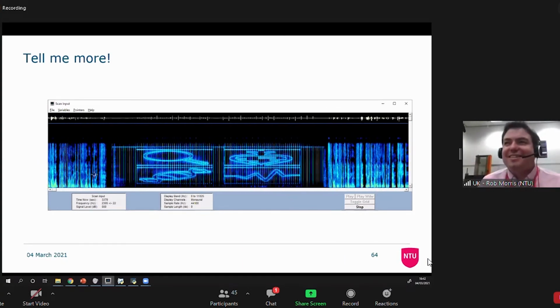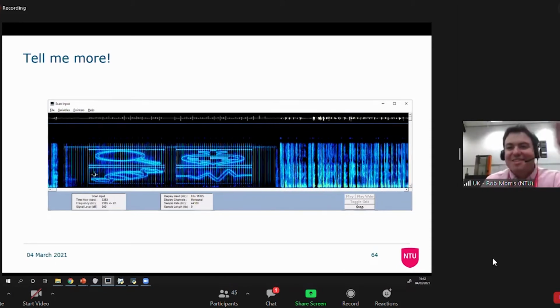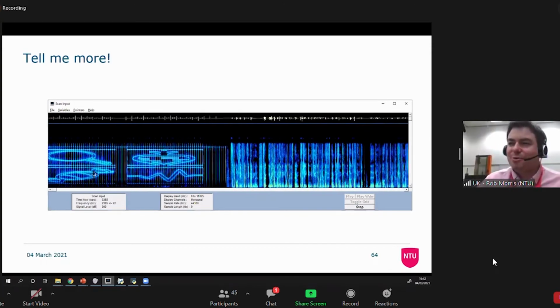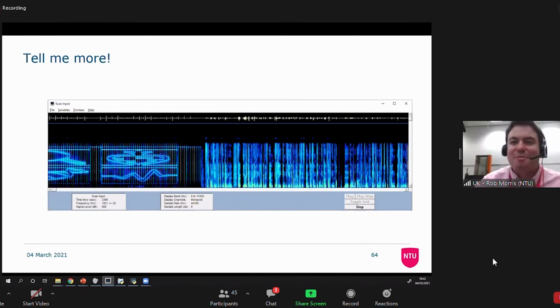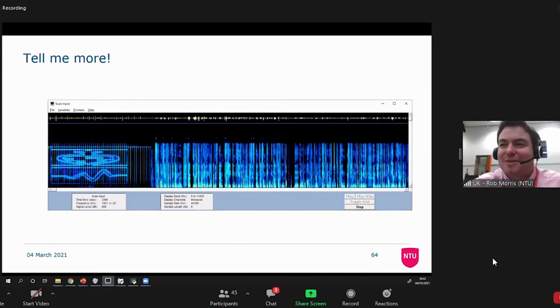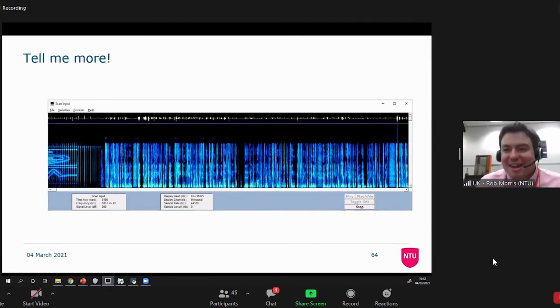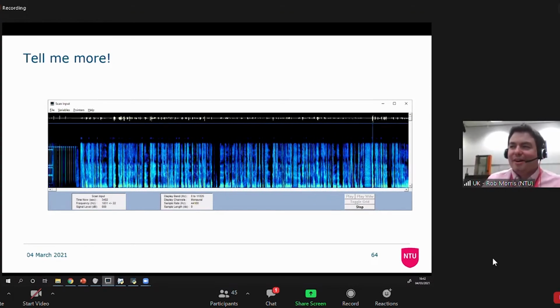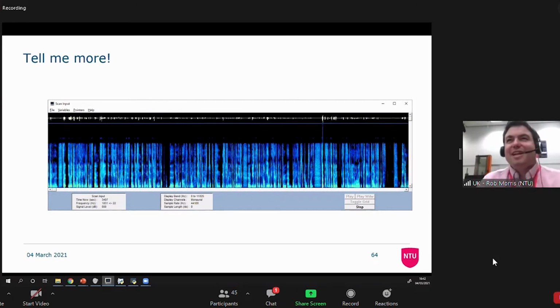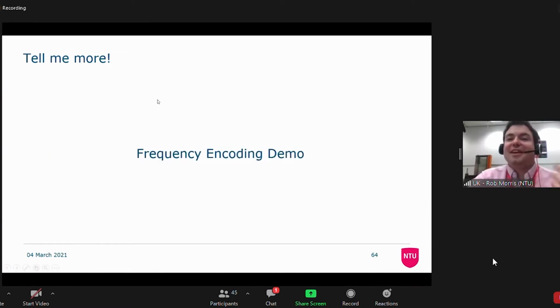It's actually used in a couple of different places. So some people encode stuff in the top, the inaudible part of the frequency range. Aphex Twin have all sorts of profane messages written in the top of their music using this technique, and you can't hear it, but it's there if you play it back through one of these kind of spectral displays. So that's frequency encoding. Exactly the same as we're doing in MRI, it's just we're using time as our second axis. We don't really use time as our second axis very much, however, in MRI. We tend to do something slightly different.